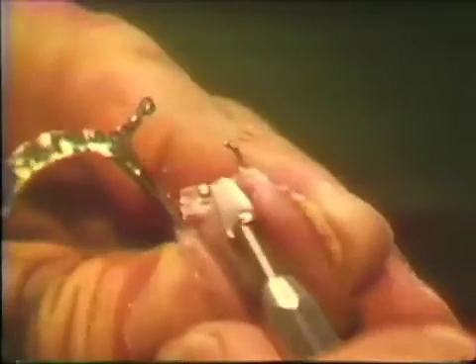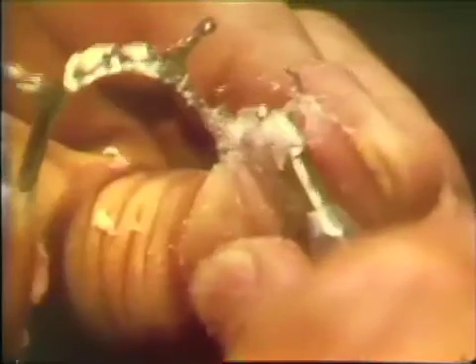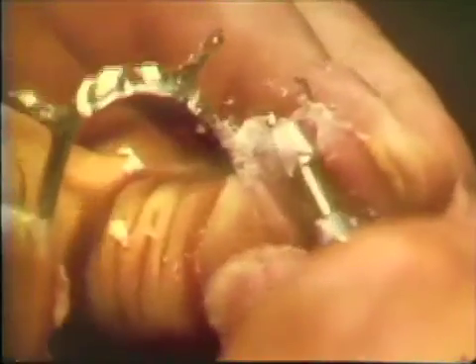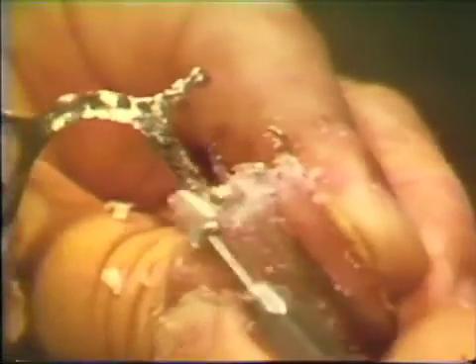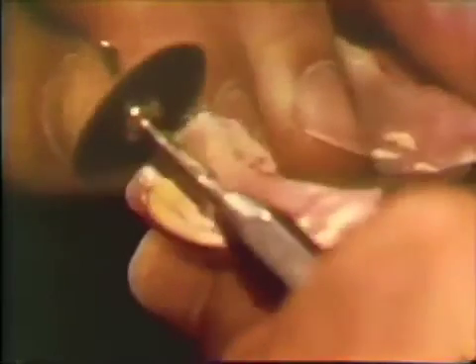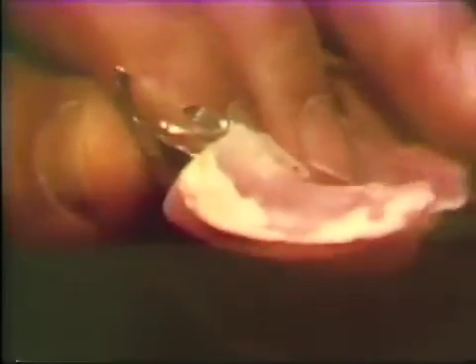All excess resin in the area adjacent to the abutment tooth must be relieved so that no pressure is exerted on the free gingival collar. The resin is reduced to the metal finishing line on the lingual bar. Excessive resin that may have been processed in and around the retentive clasp can readily be removed using a Moore's disc with a fine abrasive.